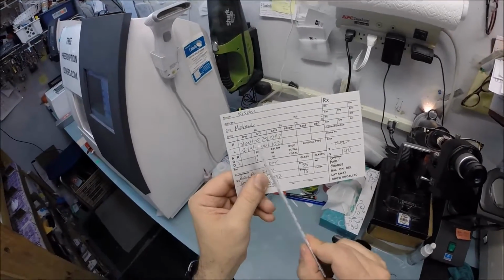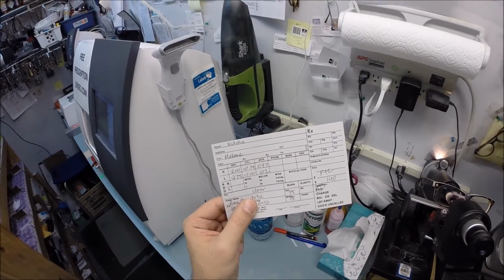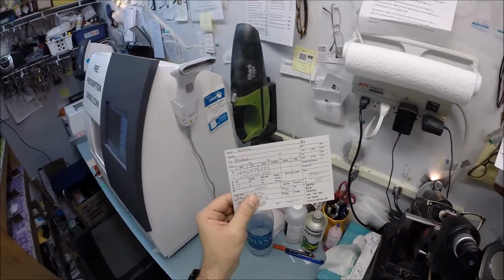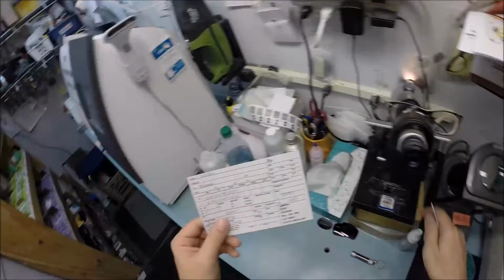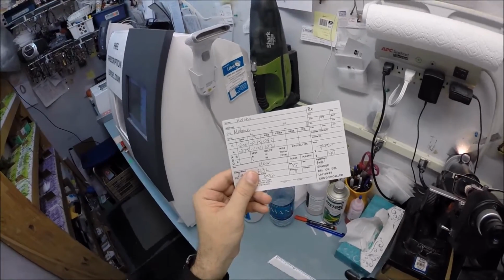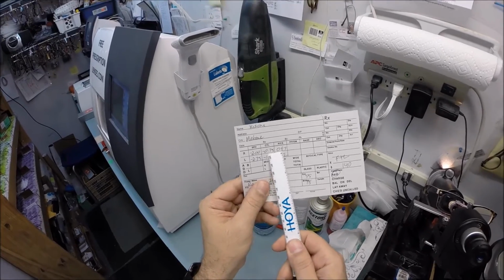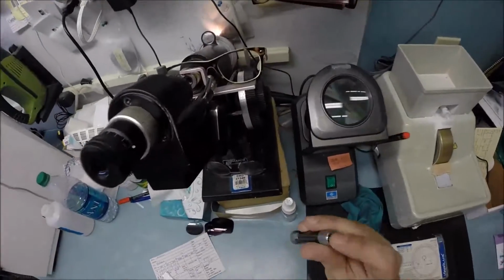Now, these first 2 numbers are real values to be concerned with. This last number could be anywhere from 0 to 180. It really doesn't mean anything. It just tells us where to turn things to make them nice and crisp. Now, the reason why we're ending up with 2.75 over here, you remember high school algebra, you add 2 like signs together? Yeah, forget about that. I don't remember it either. I'm just kidding with you. Let's use today's terms. If someone borrowed $2 and then they borrowed another 75 cents from you, they would owe you $2.75. We are at 2.75.